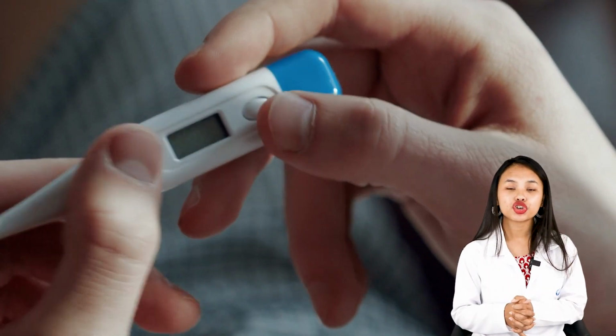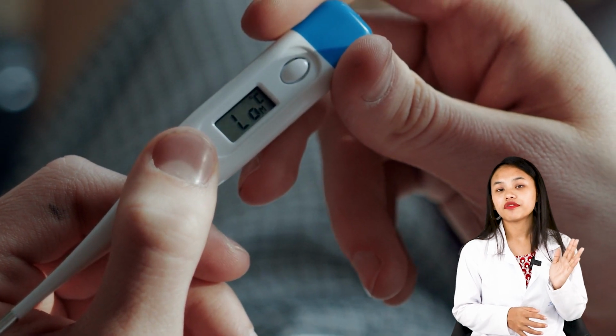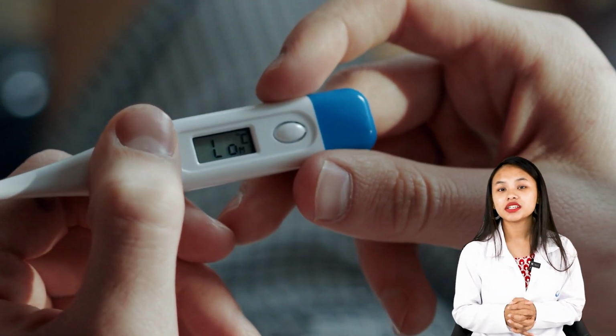The temperature of the solution must be about 105 to 110 degrees Fahrenheit, because by providing a lukewarm solution, it will prevent chilling of the patient, which can lead to discomfort.